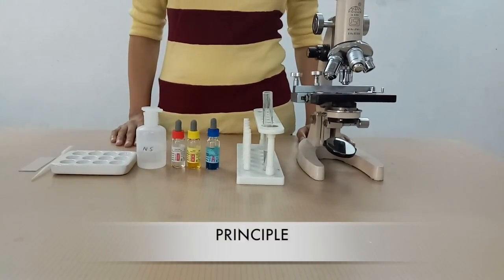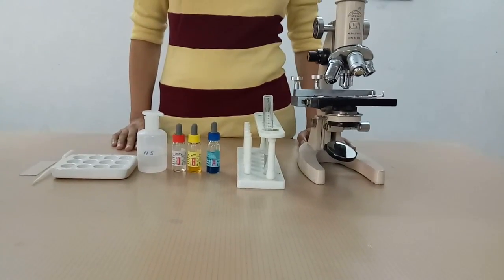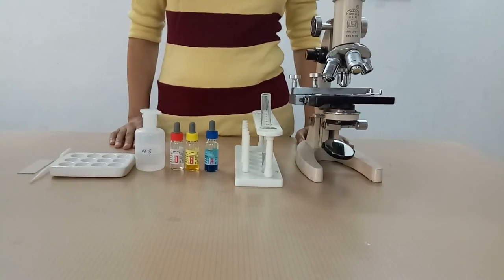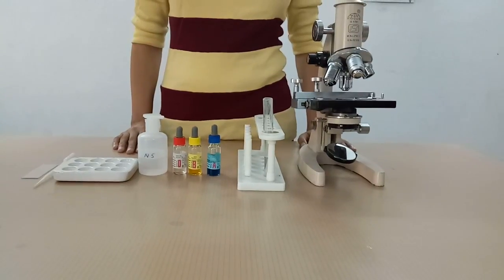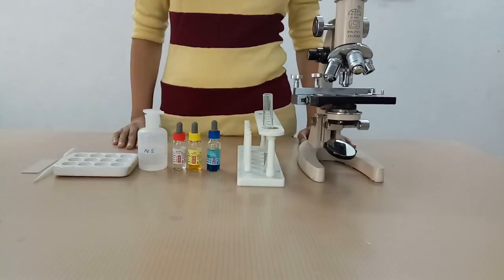Principle: RBCs contain different types of antigens, also known as agglutinogens, and plasma contains antibodies known as agglutinins. Red blood cells are allowed to react with commercially available agglutinins.